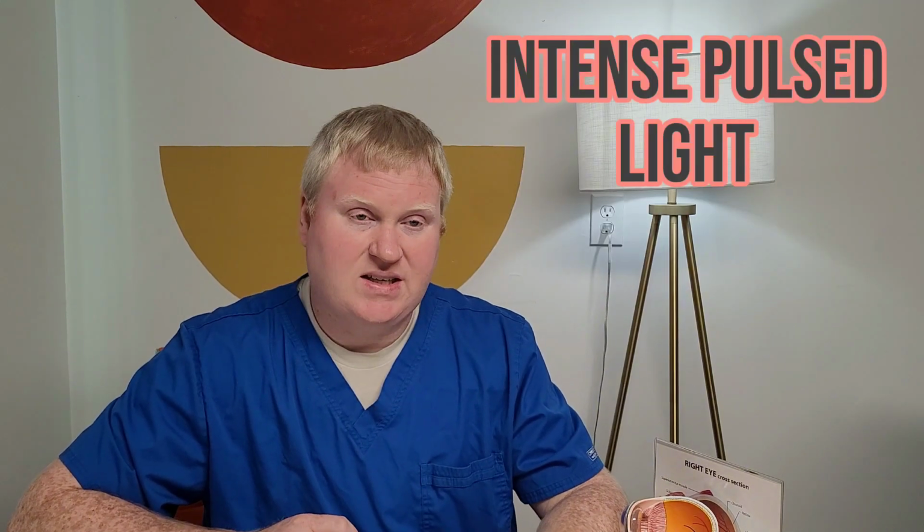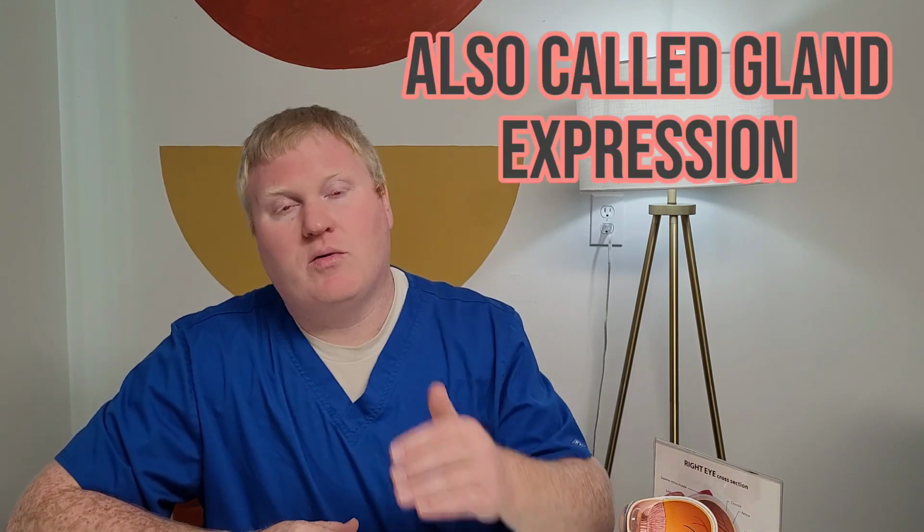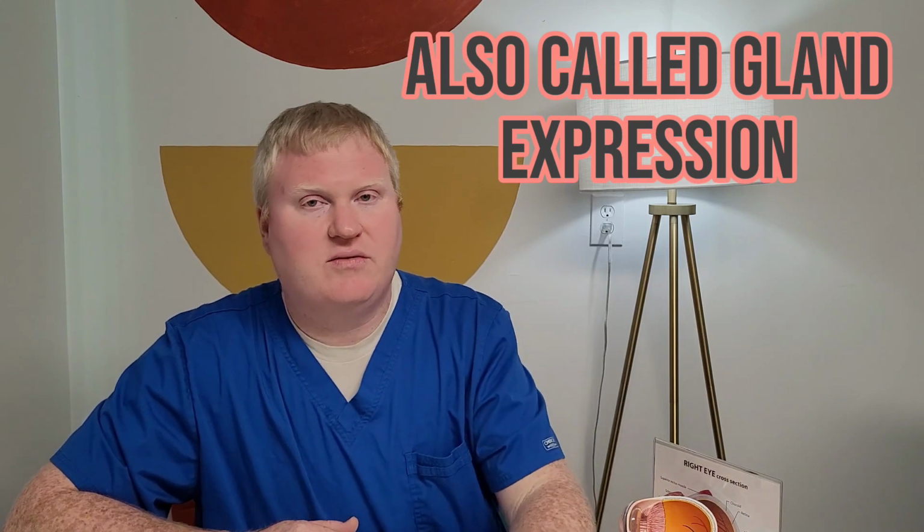So the three main procedures we do: IPL, which stands for intense pulsed light. That is a series of laser treatments that decrease the inflammation in the oil glands. The procedure we're going to talk about today is what's called the Maskin procedure. That is the procedure that opens up the top of the oil glands, and then we finish it off with a third procedure we call a thermal lid treatment, where we work on getting the old oil out of the oil glands so that new, better oil can be produced and prevent the dry eye from occurring.